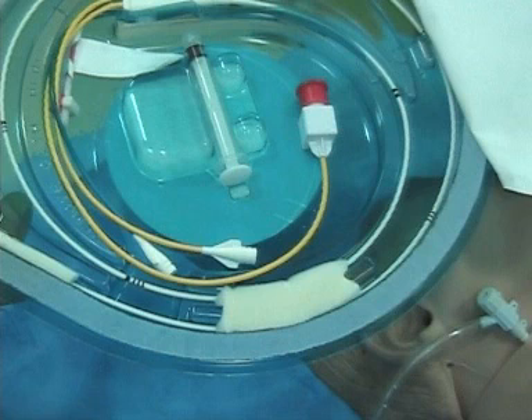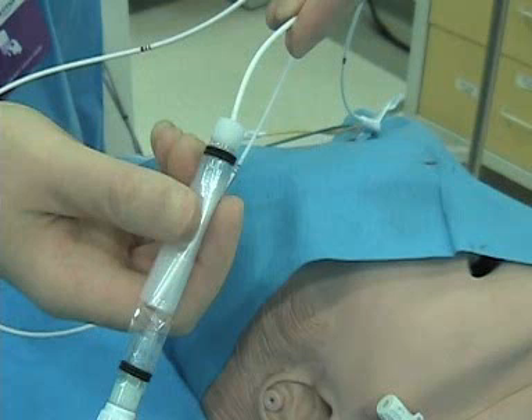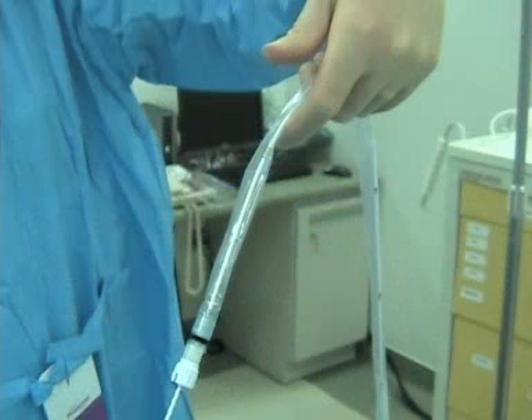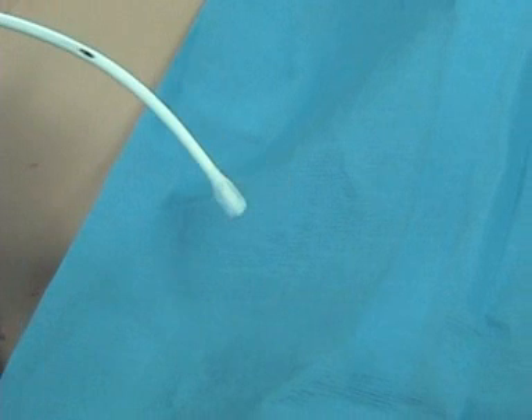Open up your kit and observe sterile technique, as always. When you pull the Swan out, make sure it doesn't bump into anything unsterile. Put the sheath on in the correct direction — yes, people have put it on the wrong direction. Make sure there's a lot of space so you don't bump into things and contaminate yourself. Inflate the balloon at the end of the Swan — make sure it inflates and deflates properly, since this is how we're going to float the Swan out. It is a flotation device.